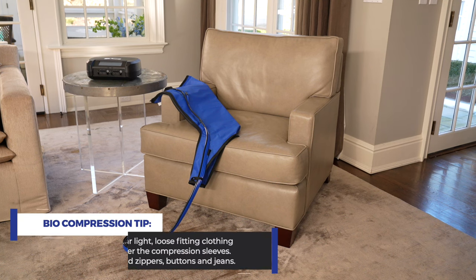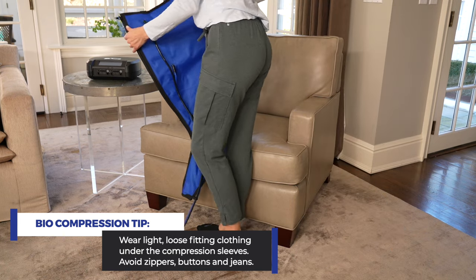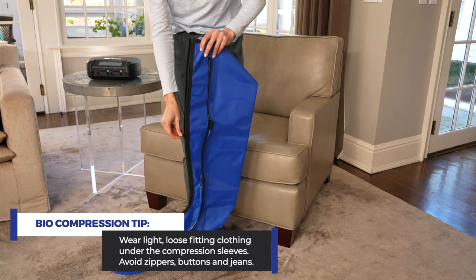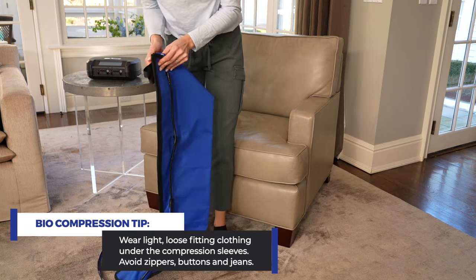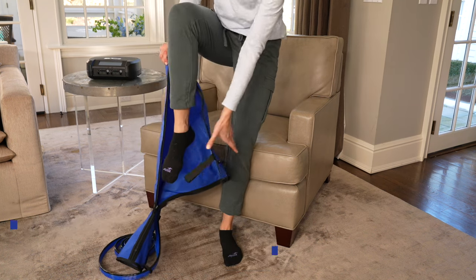Wear light, loose-fitting clothing under the compression sleeves. This is both hygienic and will avoid irritation. Clothing should be free of zippers, buttons, or other items that could rub or chafe the skin or damage the sleeves. Avoid wearing jeans or constricting clothing.